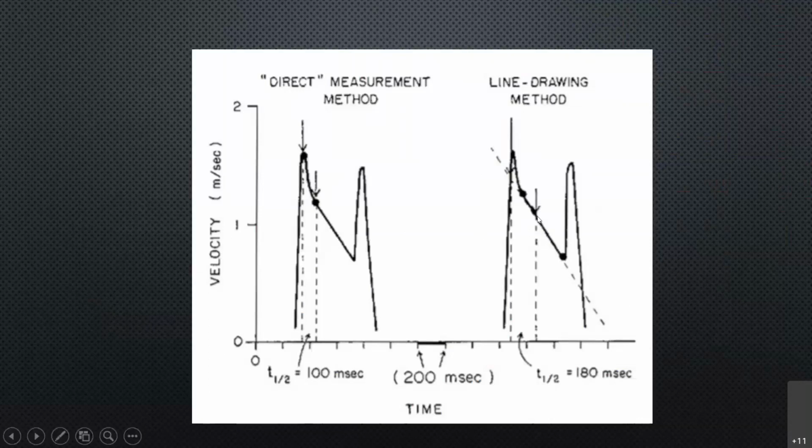So you really want to see the mid diastolic slope. Initially, all this came from Dr. Hatle's research, and she published a lot of data as to why pressure half-time is useful. I have a slide on that, so I'll tell you more then.